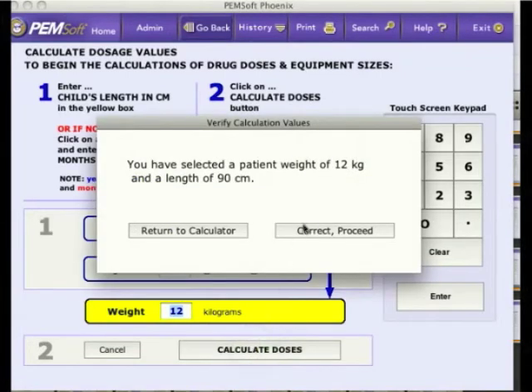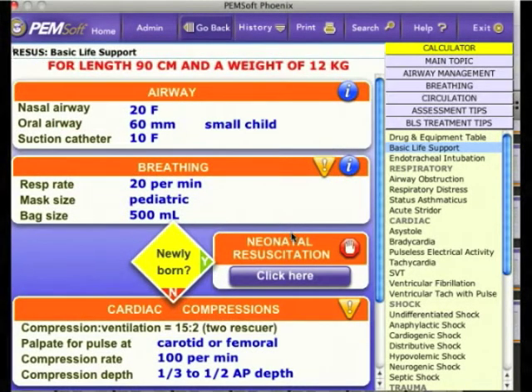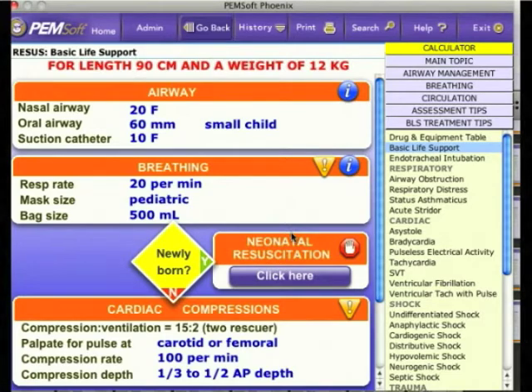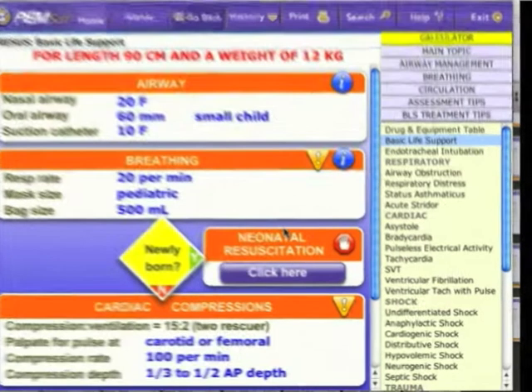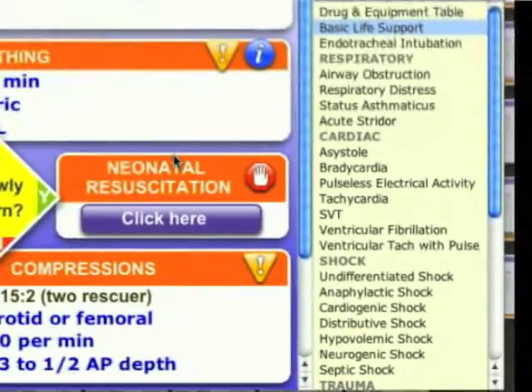Now click Calculate Dose. A safety warning window pops up to ask for confirmation that you indeed have entered the correct information. If confirmed, click on Proceed to open a window displaying drug dosages and equipment sizes, which have now all been calculated based on the weight of the child. In the lower right-hand column, there are 31 different critical conditions with resuscitation algorithms, also all now tailored to the weight of the child.